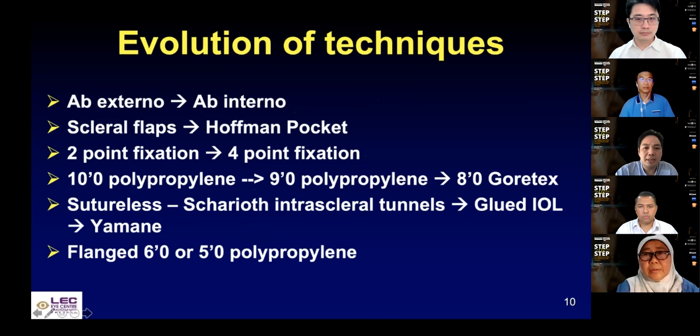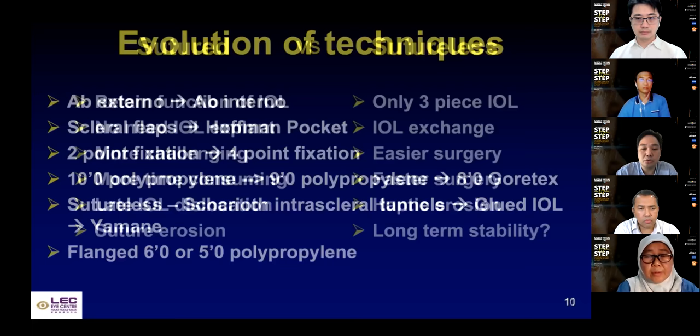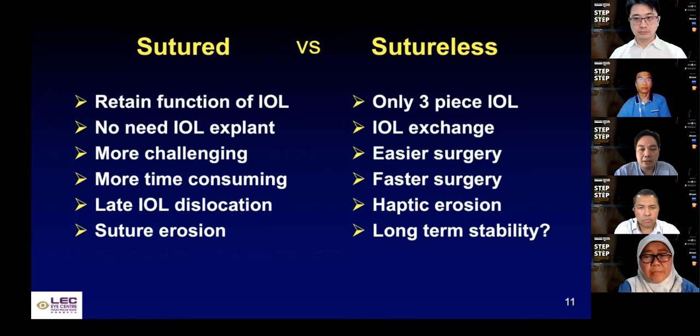One thing she didn't mention is that after the sutureless trend, when Yamane came along, and it's actually from Yamane's very innovative use of heat to create a flange, that people came up with this flange 6-0 or 5-0 polypropylene technique, which again uses suture, but not in the conventional manner. So some of the plus points that I've looked at, whether you're using suture or sutureless, these are some of the things that I can think of.